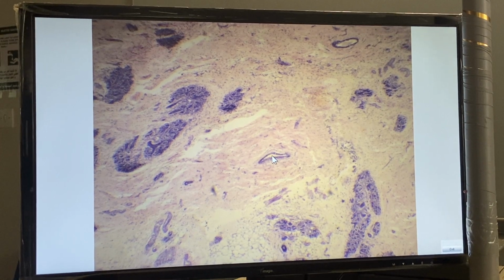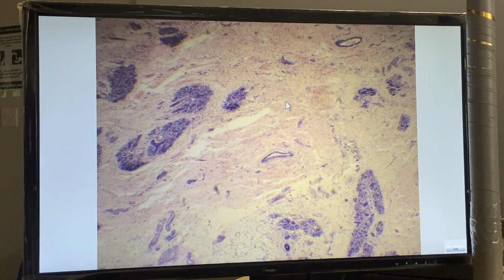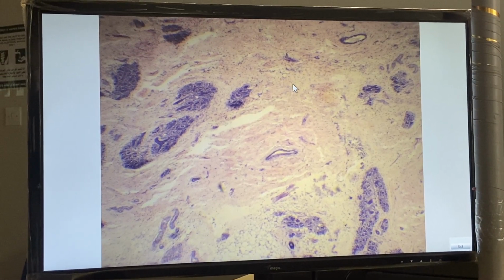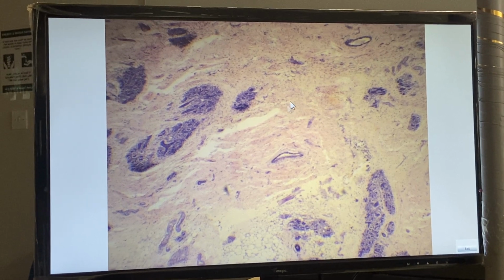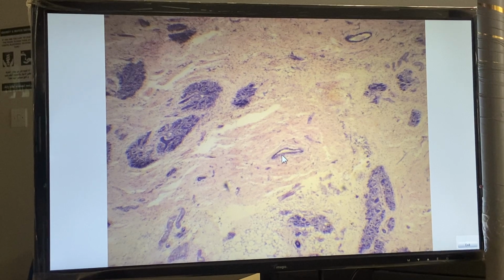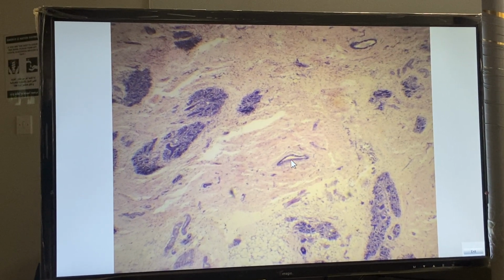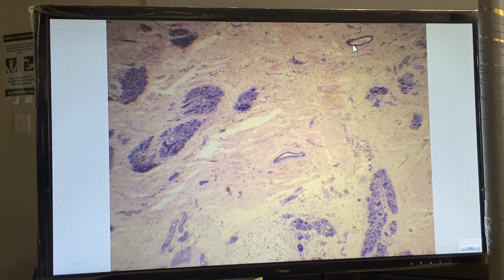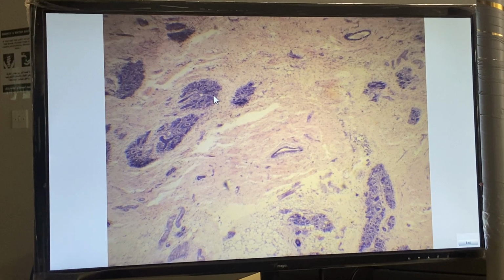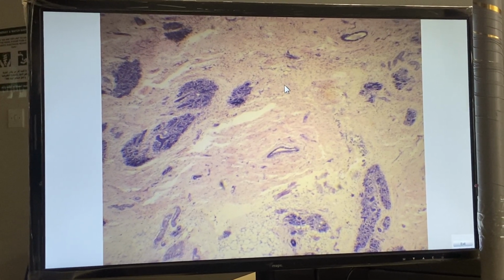These glands, tubulo-alveolar glands, are embedded in fibroelastic stroma. This is connective tissue stroma. Mammary gland during resting or inactive phase. Small duct system with small and rudimentary alveoli embedded within fibro or connective tissue stroma.